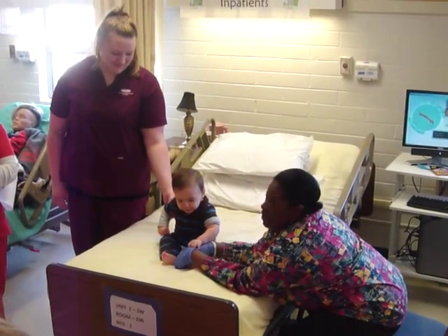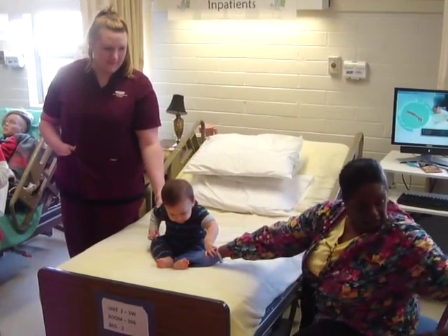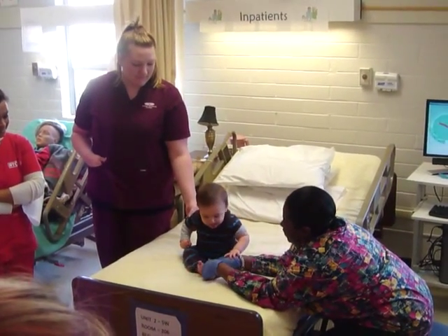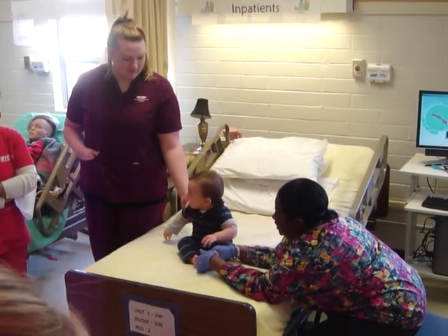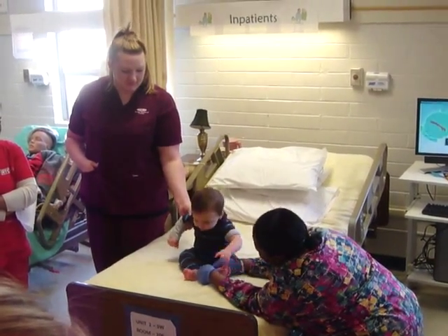The site has been warmed for the five minutes. I still have to alcohol the site. Hopefully this is a good thing — he's being interactive.